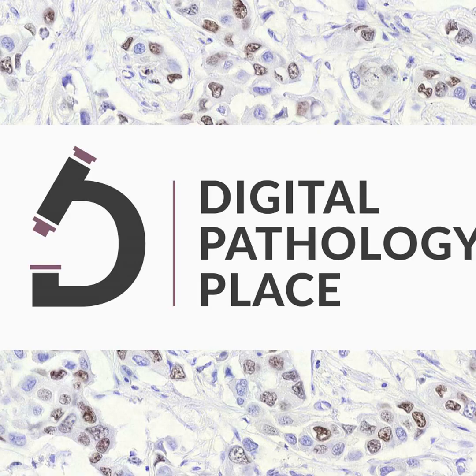Maybe you have a model for nuclei segmentation for one type of cancer, and you want to apply it to a different type of cancer. That's also a domain shift. So basically, a domain is like a group of similar images, similar data points. Like you said, a domain would be all images scanned with the Aperio scanner, and another domain would be scanned with Hamamatsu. Do I understand it correctly? Right. And a domain could be with respect to scanners. It could be with respect to the lab or the location in the world, or any other kind of grouping like that.